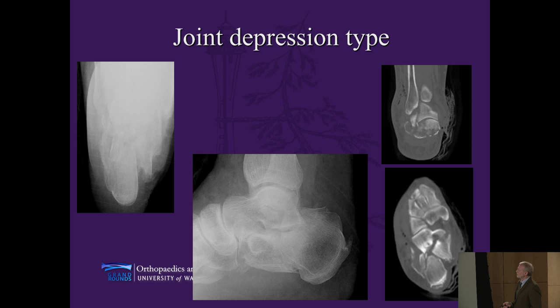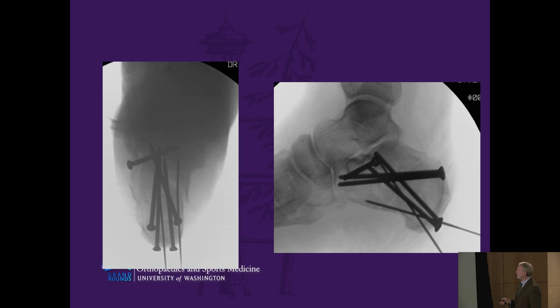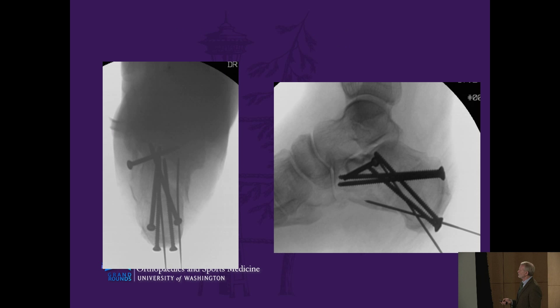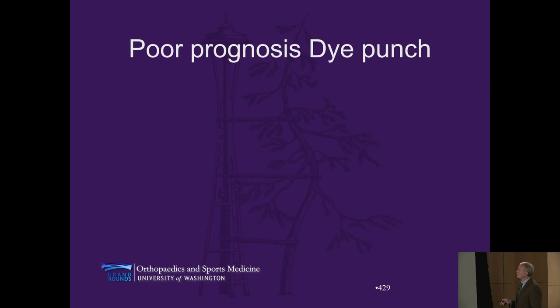This is one of Bob Dunbar's patients that was on call. We brought this patient in, washed him out, got a nice fixator, got an excellent reduction just with the fixator, and this got most of the pieces back except for the fracture in the middle facet, which we were then able to elevate at the time of insertion of the screws and wires. This is a 78-year-old patient with a poor soft tissue envelope that was open medially. This is her after the operation. This is her at 1 year back to relatively normal function with pretty good movement.